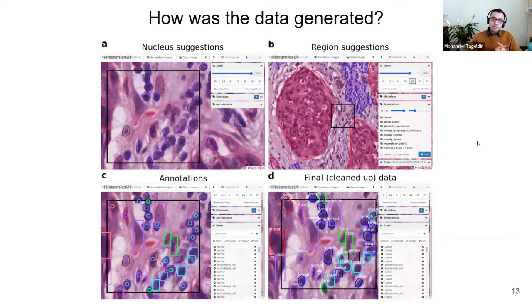So the reason I told you about the region annotation project is we didn't want to have the participants draw the individual boundaries around the nuclei. Now, nowadays, there's something called NuCLS that I'm sure you guys are familiar with. You developed it.